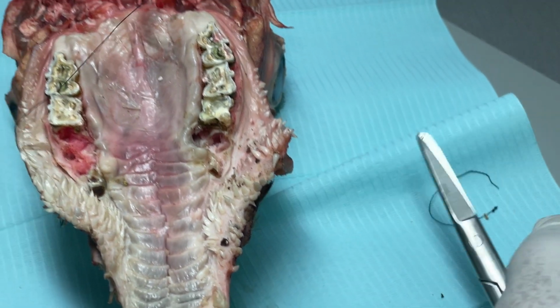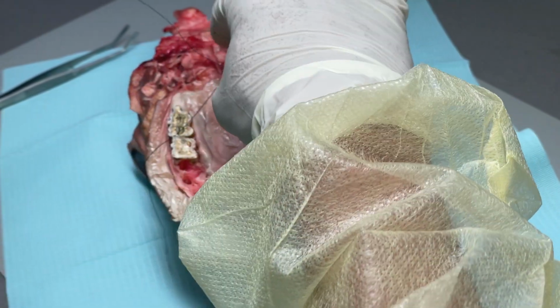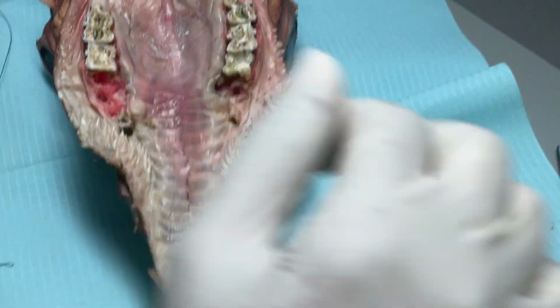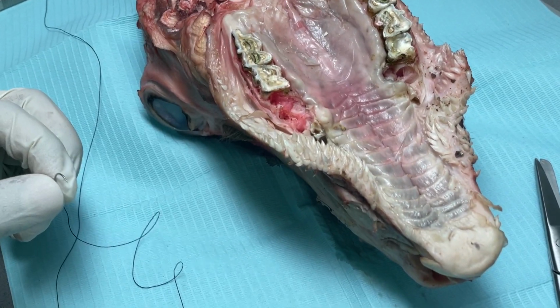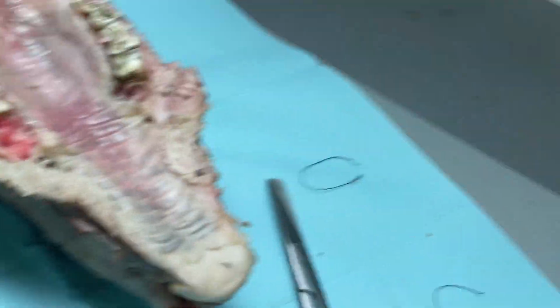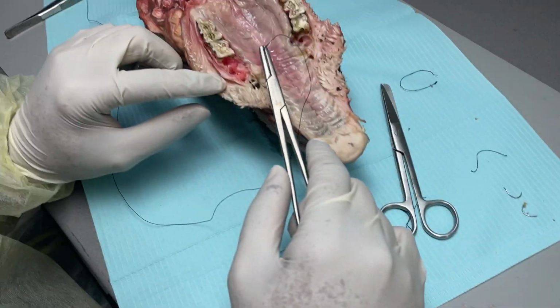So we did simple interrupted, figure of 8, and extraction socket. Now I'll show you horizontal mattress. Continuous we don't prefer. There is with lock and without lock. No need with lock, we will do without lock. Is there enough needles for us? Yes, if it's not there, we'll give you. Don't worry.